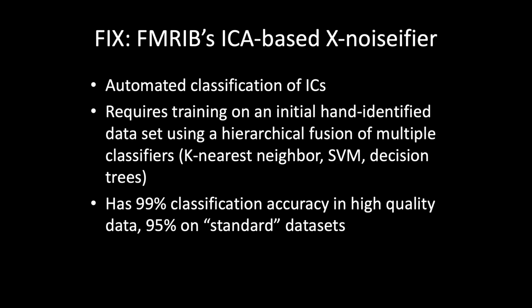So what's nice about Fix is that it's an automated classification of these components. The software itself requires some training on a hand-identified data set. What's nice, though, is that if you're using the HCP protocol, they've actually already got a training data set there for you, and we're playing with that right now to see how well it works with our data. But it's been determined to be very accurate. If you have high-quality data, the argument is that it's at about 99% classification accuracy.